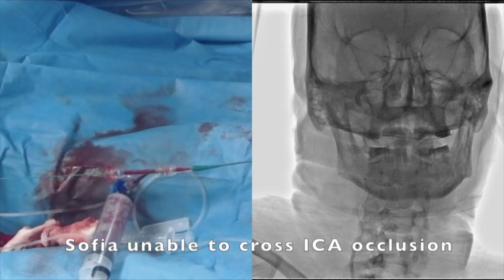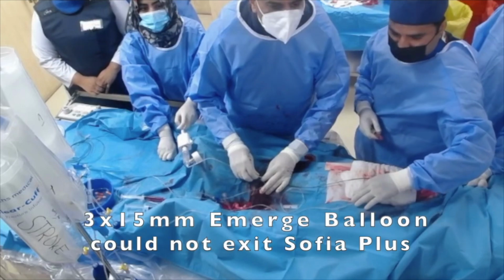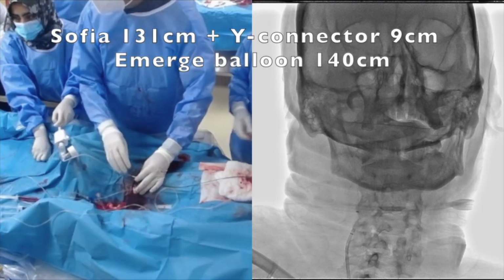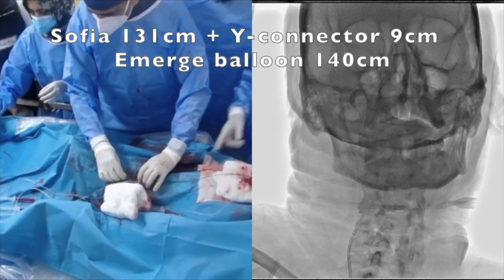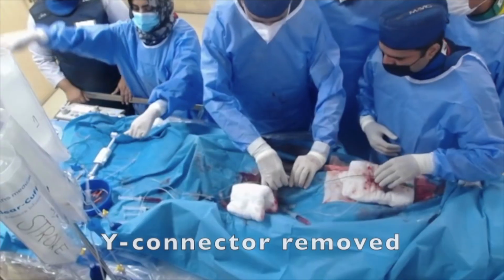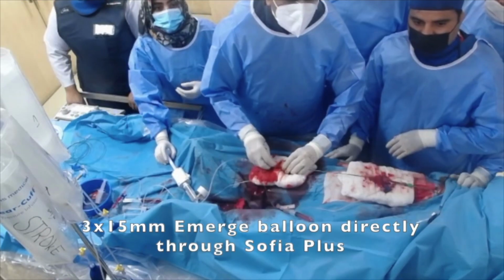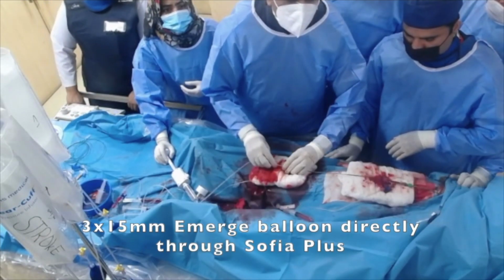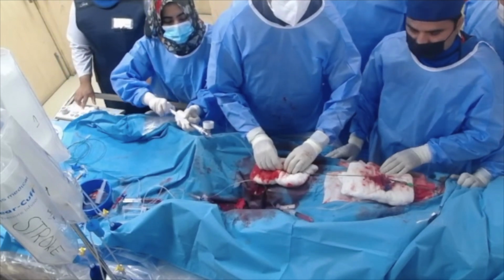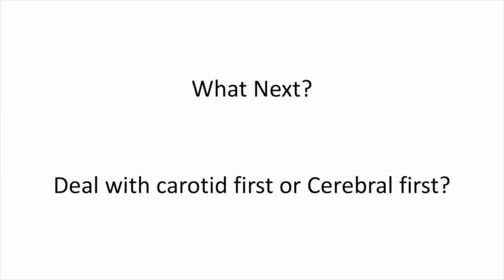So then the next plan was I removed the microcatheter Rebar, and through Sophia on the wire I took a 3x15 Emerge balloon, but it could not exit Sophia Plus because Sophia Plus with Y connector was 140 centimeter and the Emerge balloon itself was also 140 centimeter. So the next plan was I removed the balloon, I removed the Y connector, and on top of the wire I just took the balloon alone in without the Y connector, and then I was able to take the balloon across and inflate the balloon at the site of occlusion.